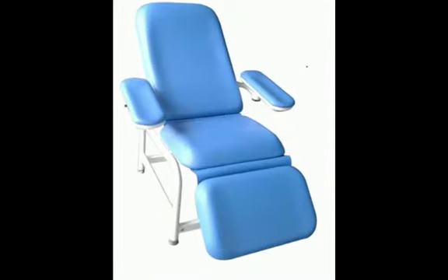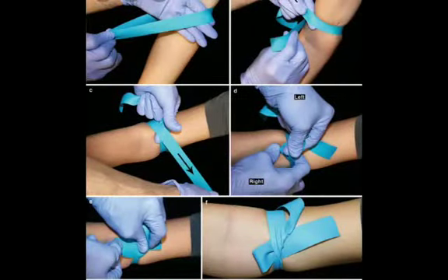The procedure of venipuncture: at first you have to position the patient in a sampling chair as shown in the image. Wash your hands. Select a suitable site for venipuncture by placing the tourniquet 10 up to 15 centimeters above the selected site of puncture. Do not put the tourniquet on too tightly or leave it on the patient longer than 1 minute.